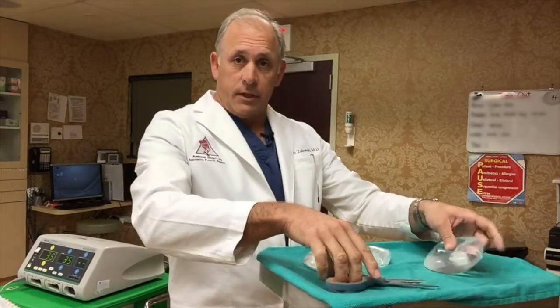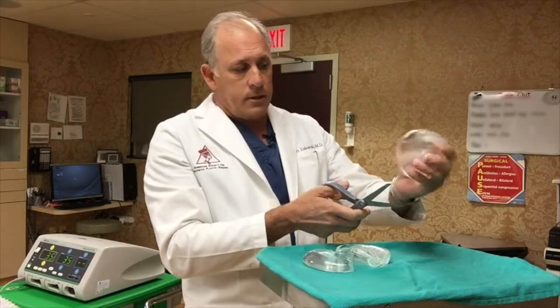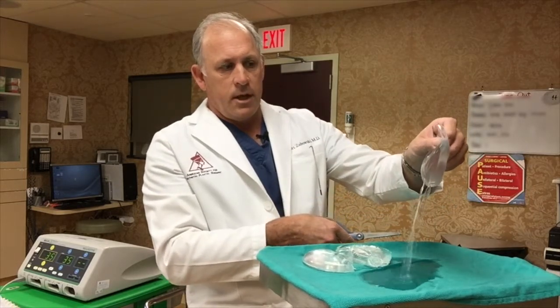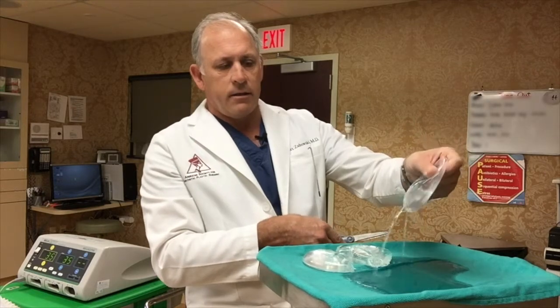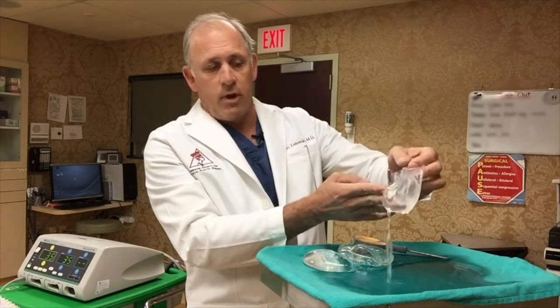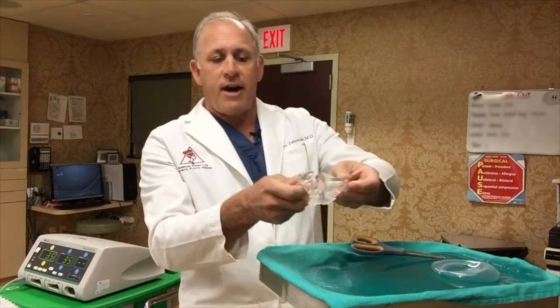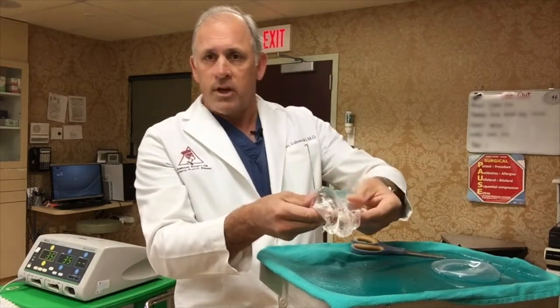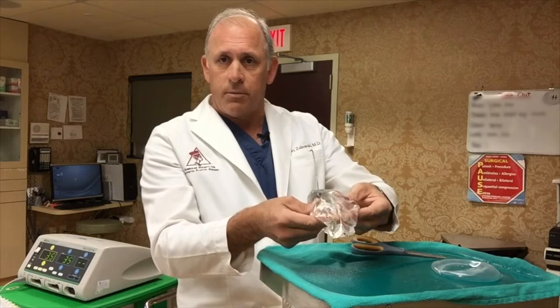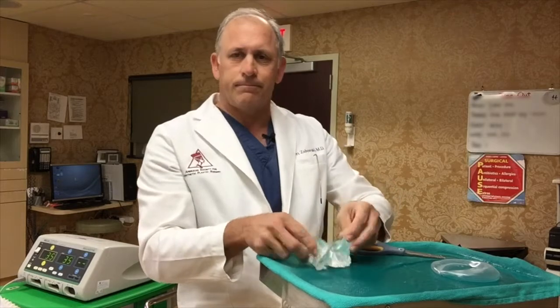A saline implant, if it leaks, will simply be absorbed by the body. This is a saline implant, and if there's a little hole in it, as you can see, the saline runs out, gradually deflating until there's no more volume left. So your body will recognize the deflation right away because there's no more volume. On the other hand, with the silicone implants, because the volume is still within the implant, your breast won't change size. And that's the difference between both of them, and why with a silicone implant you typically need an MRI to detect a rupture. That's the difference.